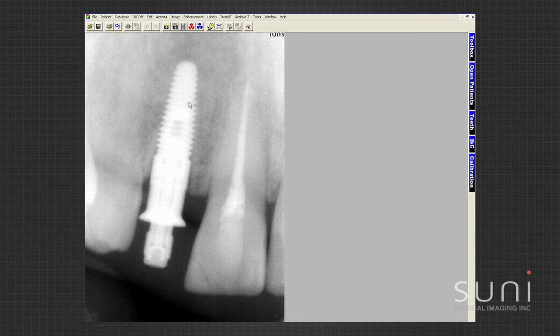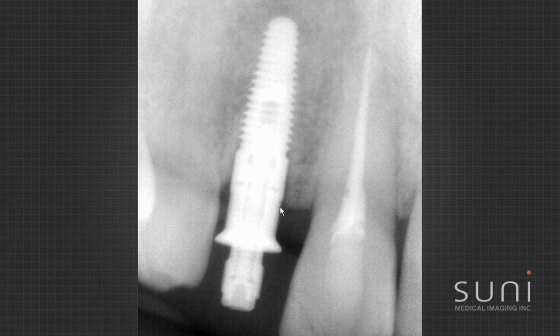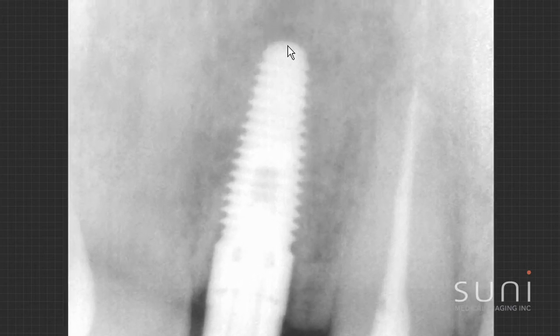This is an implant case. I've placed my implant, and now I'm looking to see that the implant head and neck is at the level of bone that I want it to be, and that the bottom of the implant is at the bottom of the hole that I drilled. It looks like it's screwed in really well, everything looks nice — I have clear, great image quality for implants.